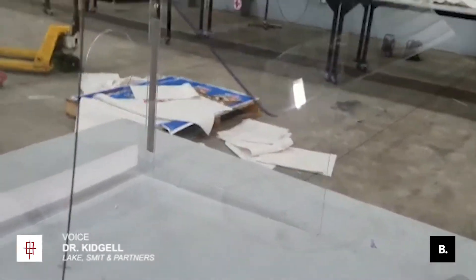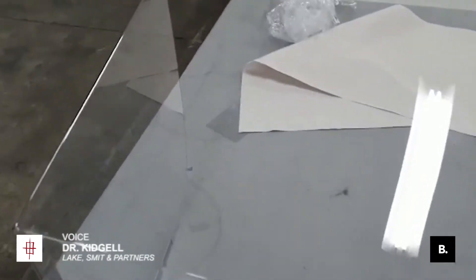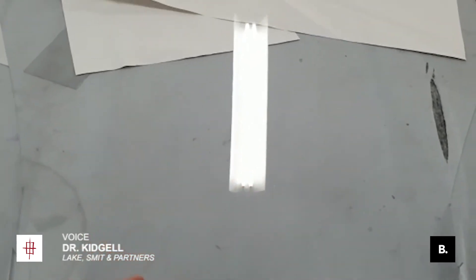The patient's head is obviously in the box. They're lying in there. And you can come, you can look from the top, you can look down, see the patient, and you can work in here in a completely sterile environment.